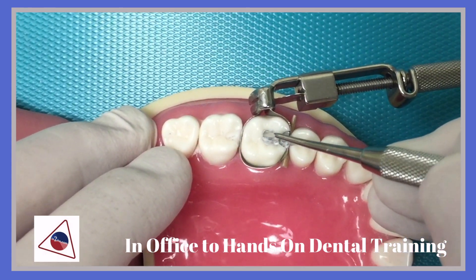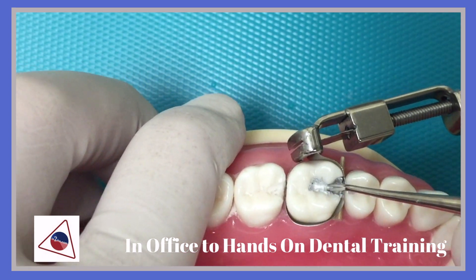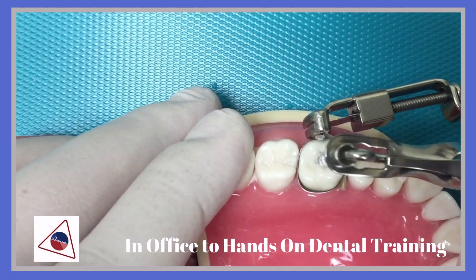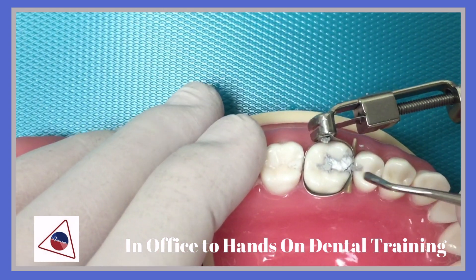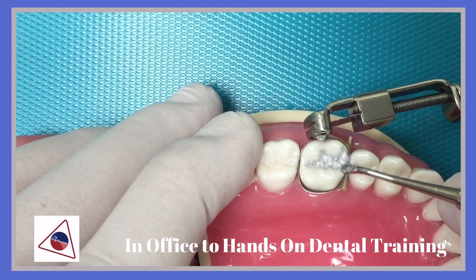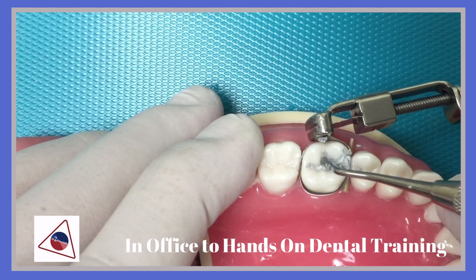We'll go ahead and speed this up so that we can get into the portion of the demonstration to do the occlusal anatomy, the proximal contour, and the gingival adaptation. But very critical, after the condensation of the amalgam, is being able to burnish the amalgam material towards the margins of the prep.